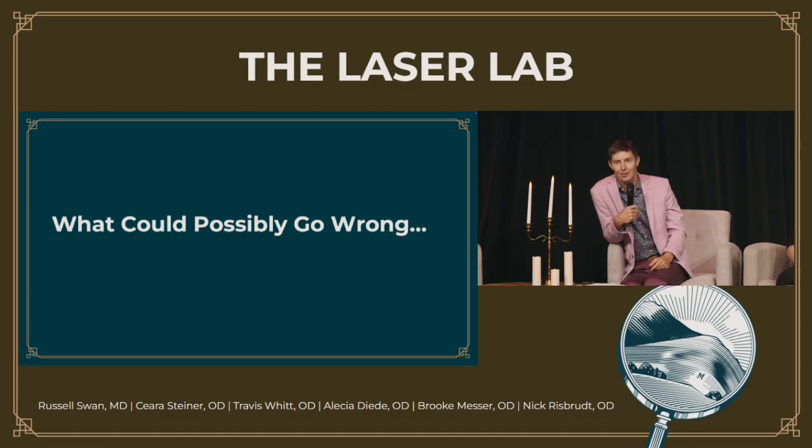Okay. So yeah, you don't let them stay hand motion for the next 3 months saying, we're just going to give it a little time, let it settle. Yeah, they get an instant YAG and they're instantly much happier. So yeah, good question. Okay, so YAGs, what could possibly go wrong?